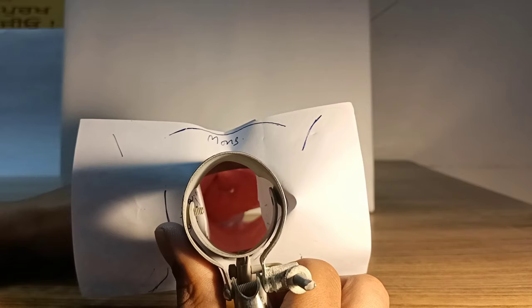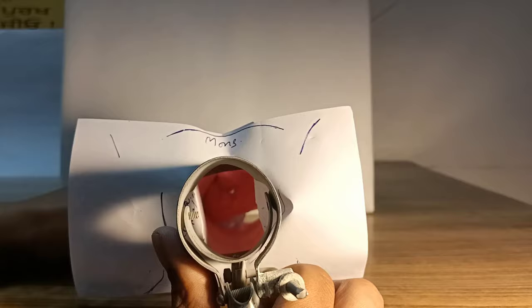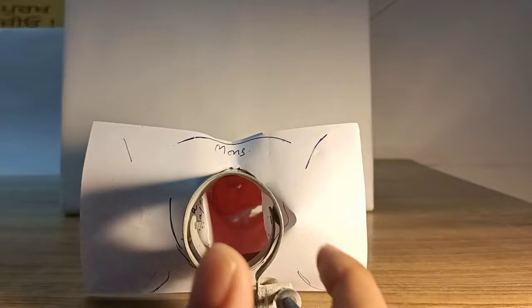This would be the area of my interest from where I will take the pap smear, and I can adjust this screw right over here so that it does not get closed.